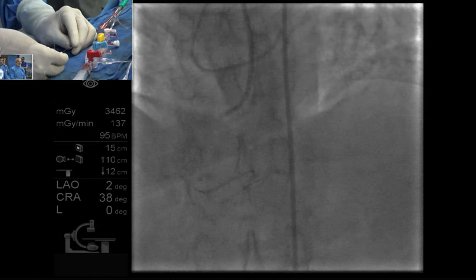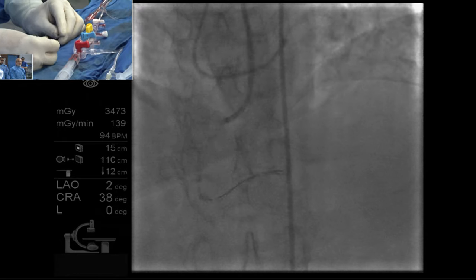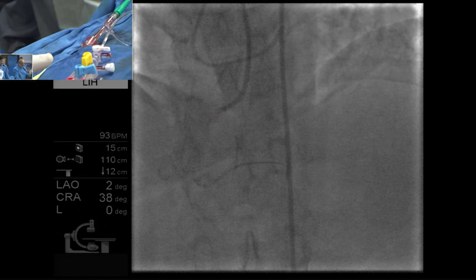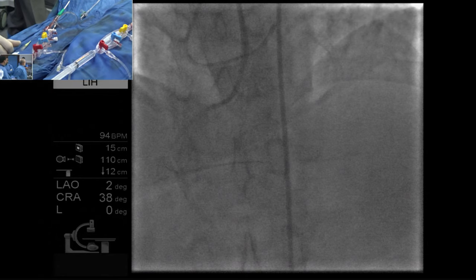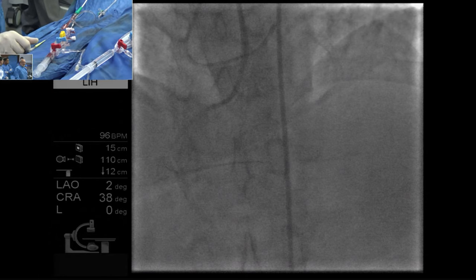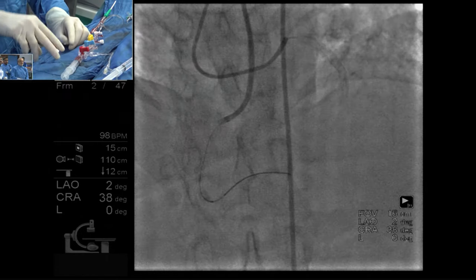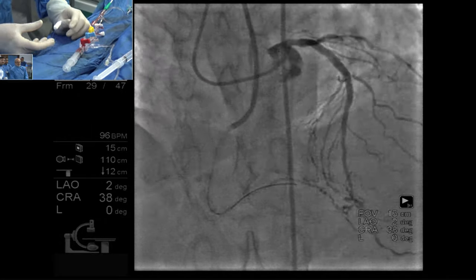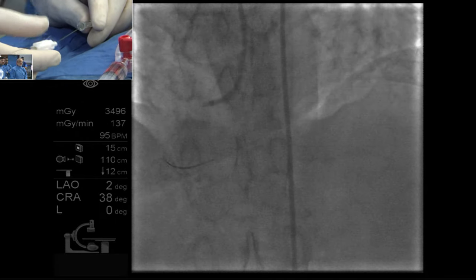I will work for another 5 minutes and then quit, because if you are going to go in, you go in with this time. That's it. Is it worth trying to get into the PLV and then ballooning? Can we see the view? How to enter PLV? From the beginning. Yes, and then balloon that segment, and maybe that helps you then get into the PDA. Just see, Sanjay, retrograde.